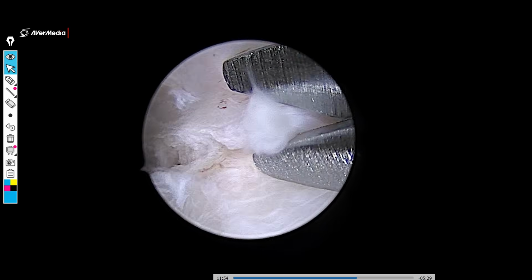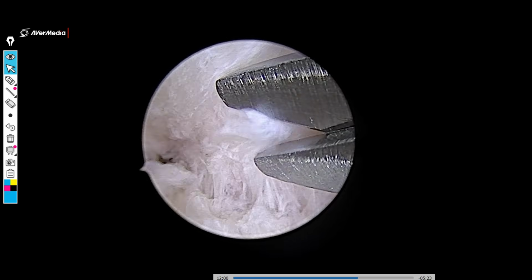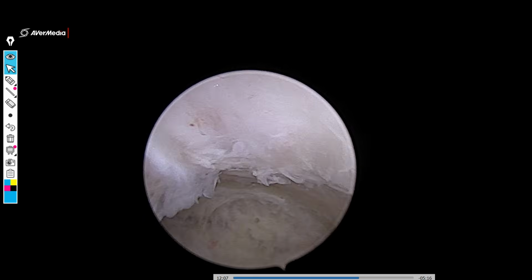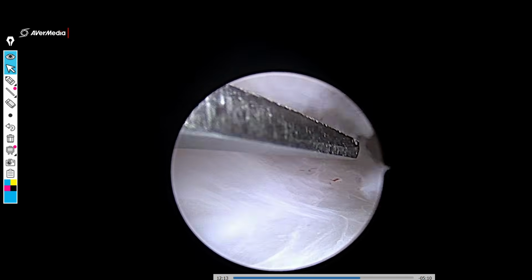We will have to give her a 3-month treatment with medicines like Proginova. We will have to give her an intrauterine Foley's balloon for separation, and then we can only see what the healing is at the end of 3 months and decide what the outcome of this surgery will be. So you can see this is on the right side and on the left side.